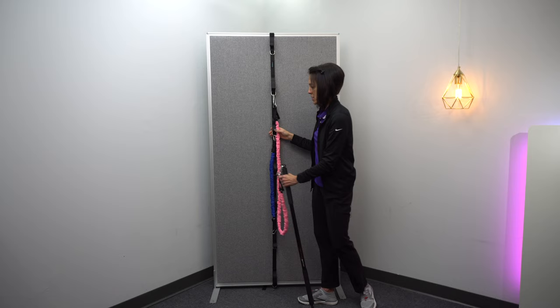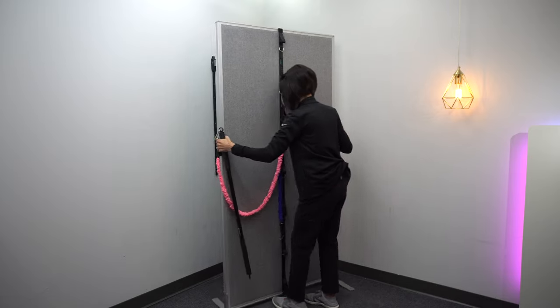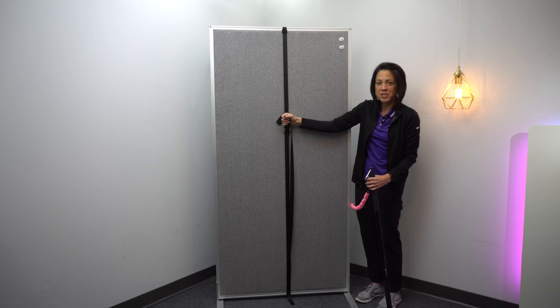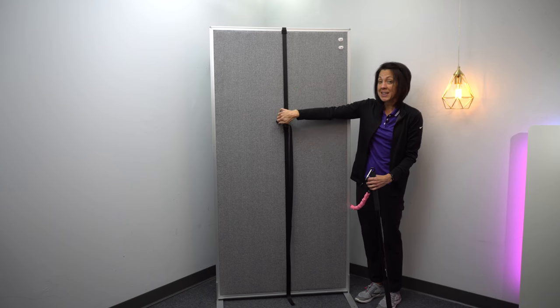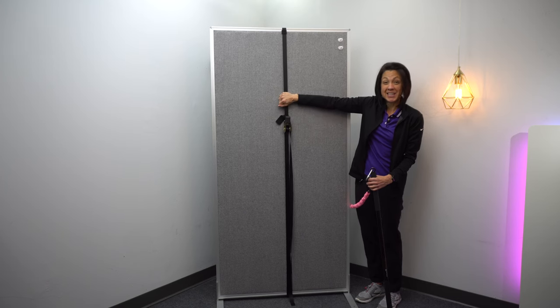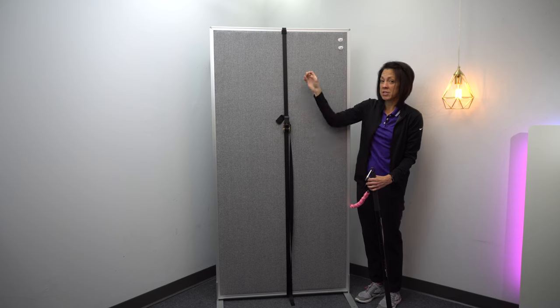So let me show you a couple of things about this. It basically just has one of those like ratchet straps, and so you can get it really tight. The reason that's important is I really didn't think that it would stay in place on a door. I thought it would just kind of slide up and down.